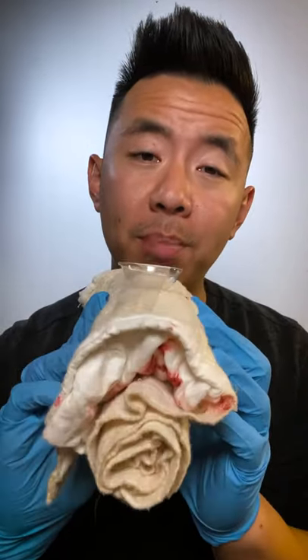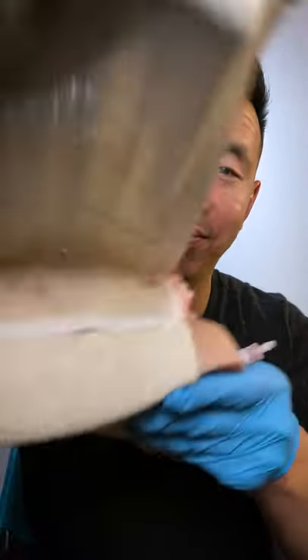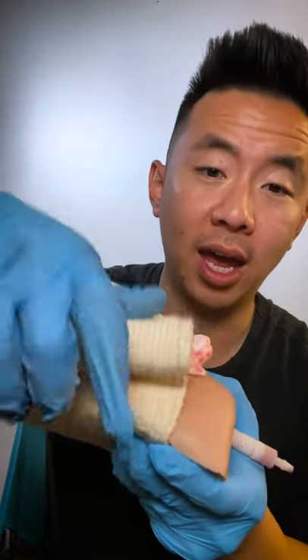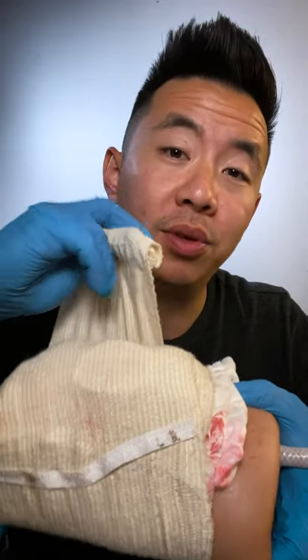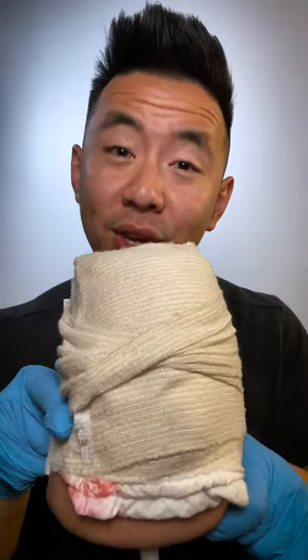As you can see, the Olase Bandage is bulkier than most and it has this little compartment over here with compression gauze. You position the bulb right on top of the wound and you just wrap. The cool thing about this dressing is it has velcro stops, so once you go over and drop it, it stays in place. And if you want additional pressure right on top of the bulb, you can twist as you're wrapping. Secure in place and you're good to go.